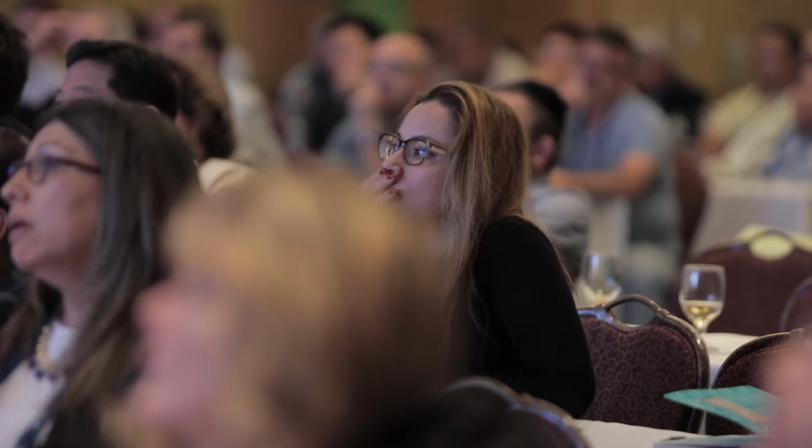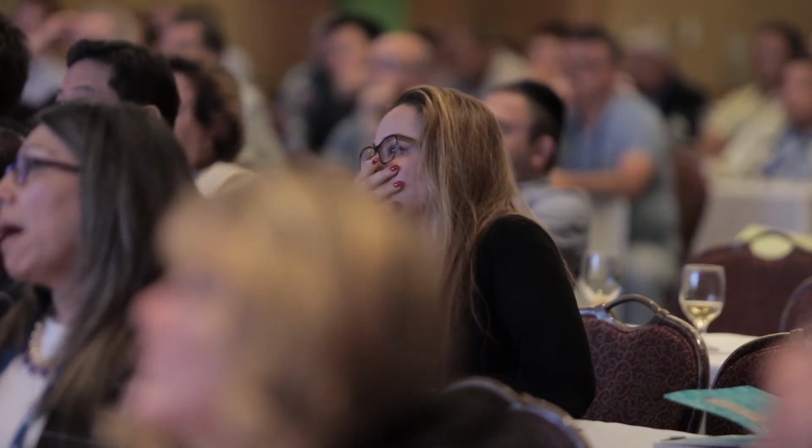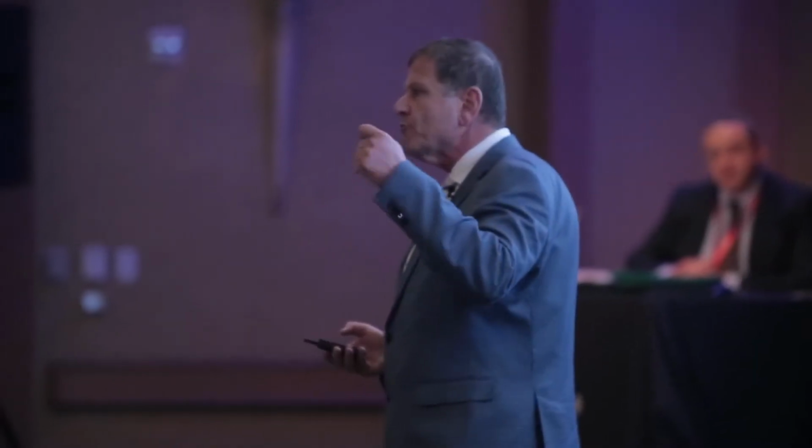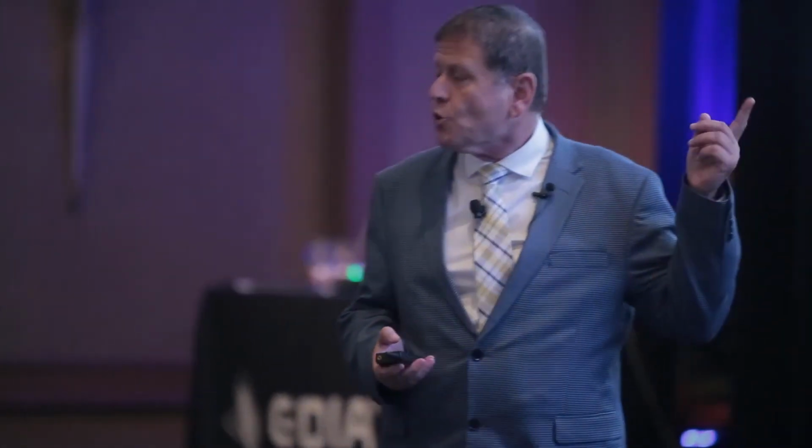When we work with granules that are not resorbed, the bone that can form is just in between the tiny spaces that exist between the granules. Therefore, we are always taught not to condense our granules, because if we do so, we will probably not have bone. Even after 6 months, we are going to find some granules that were not integrated. Now, if the graft is of good quality, we will speak about integration. Integration? Where is the regeneration?